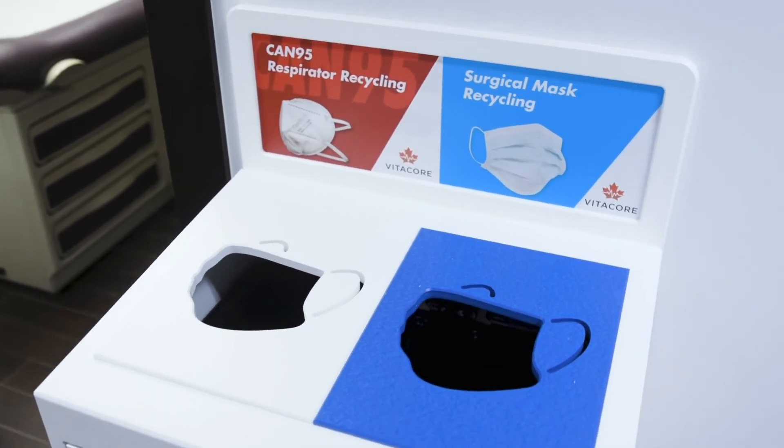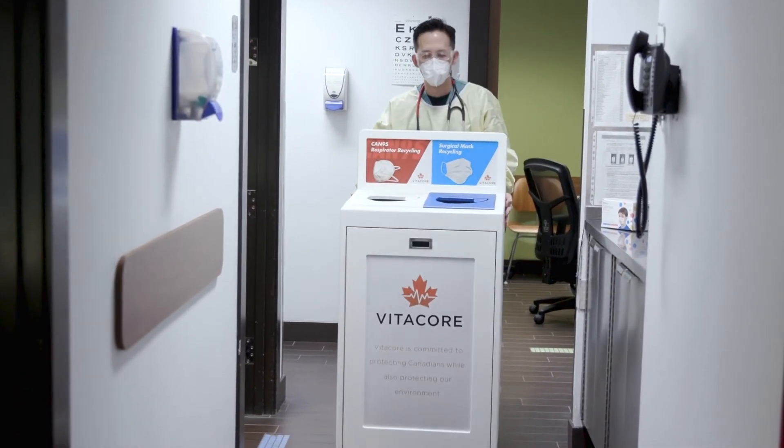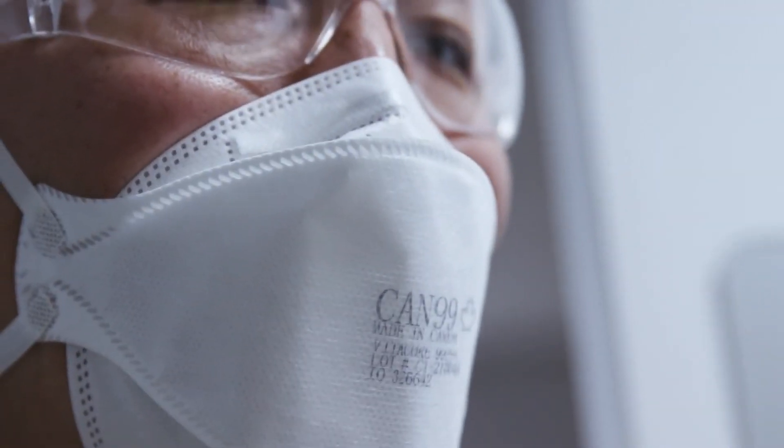Recycle your respirator as part of VitaCore's recycling program, or dispose of used product in accordance with your occupational health and safety regulations, followed by proper hand hygiene. VitaCore — keeping healthcare workers safe.